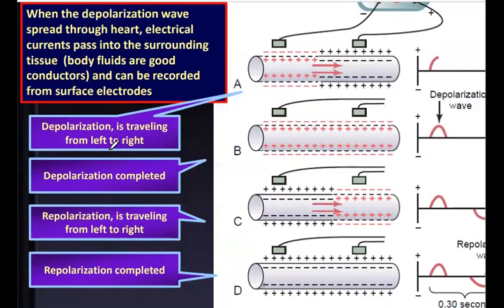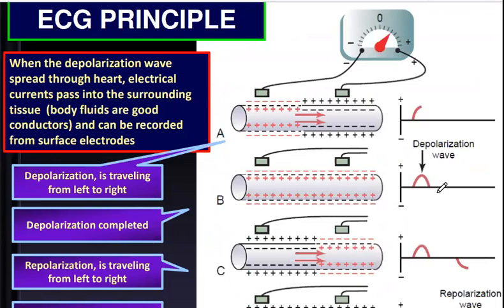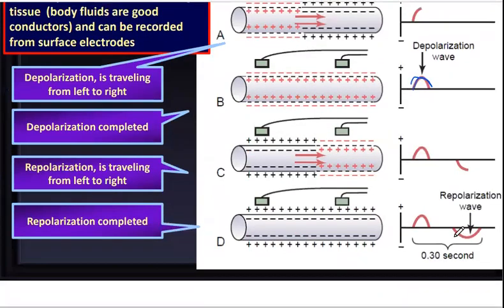So this is the repolarization wave. You can see here. This is the depolarization, this is the electricity generated. This is the repolarization, again in resting.